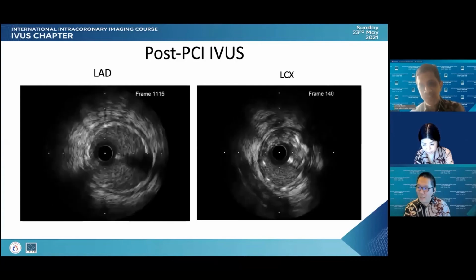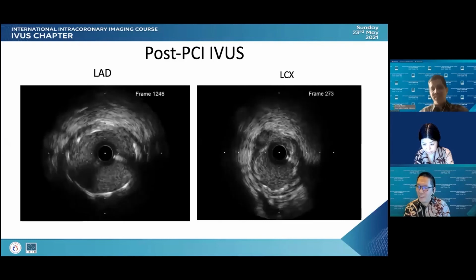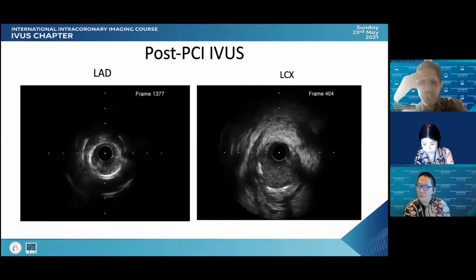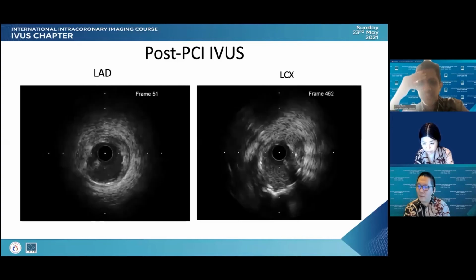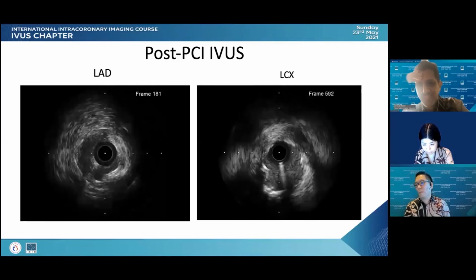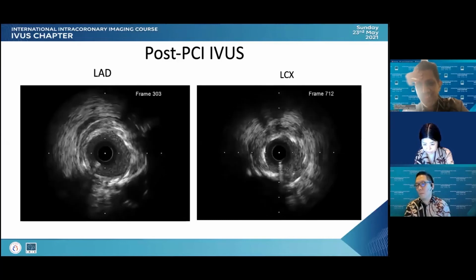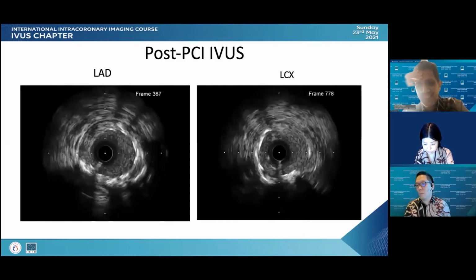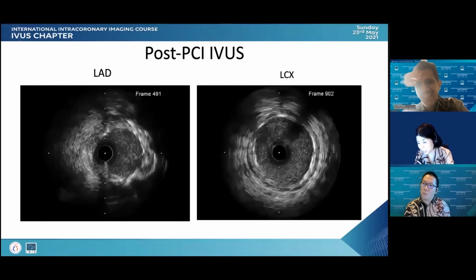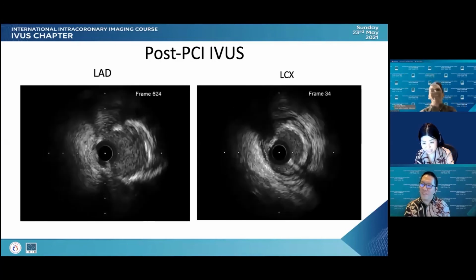So starting the non-stent segment, which is the distal segment, and now you see the stent, there is no edge dissection, that's good. And actually the landing is really good, meaning you didn't leave some disease, right? And then we are coming to the proximal, and there is a calcified eccentric calcium at 9 o'clock, but I would say okay. And you see the ostium of the circ. Maybe panelists will reveal what it is.